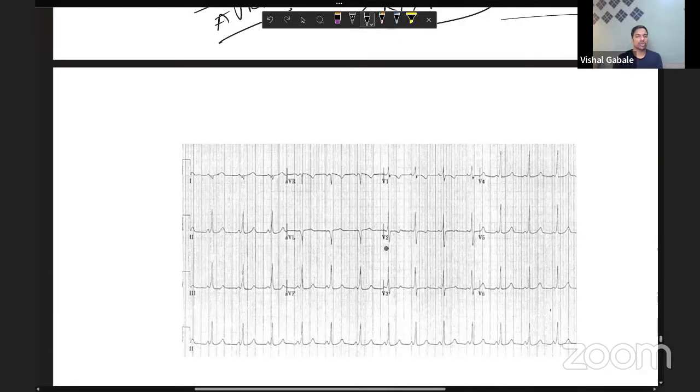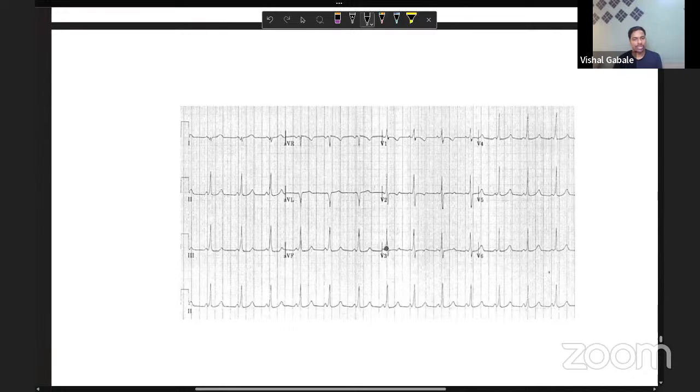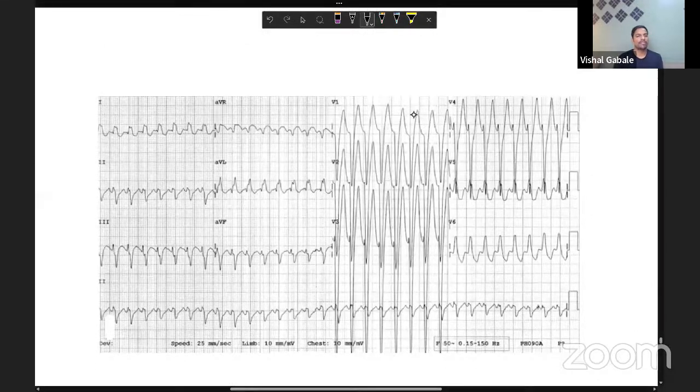So that's a theoretical point, but knowing it is all right. If you don't know, that's okay, because it's the SS part. Basically, electrophysiologists should know that, not even all cardiologists. So that's okay. Now identify this one, guys. What is this diagnosis? You know this. Even with closed eyes, you can answer this one. Can anybody? Yeah, it's WPW. I've already written AVRT also here. Now identify this one, guys.